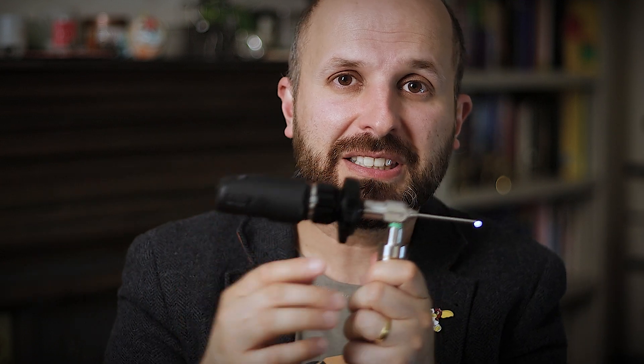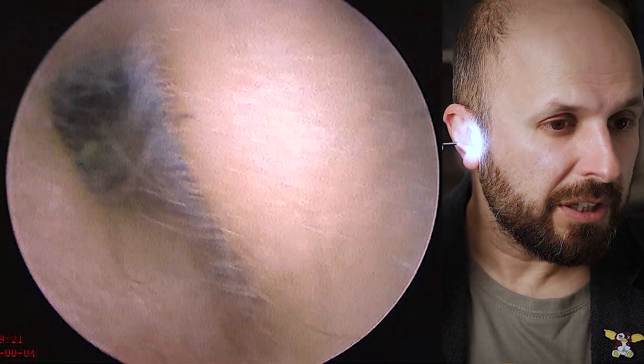Hi there, my name is Vic Veer, I'm an ENT surgeon. What I want to do today is show you what a normal ear looks like. I've got my little device with a camera attached to it and there's a video that's going to come up, so I'll move over to one side. I'm going to put it into my ear so you can see what's going on.